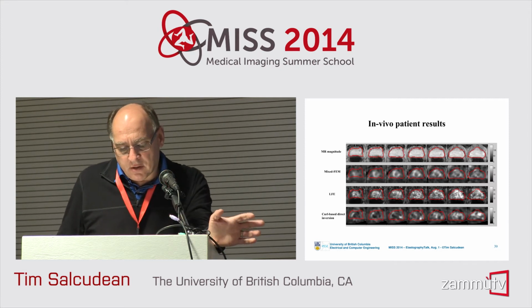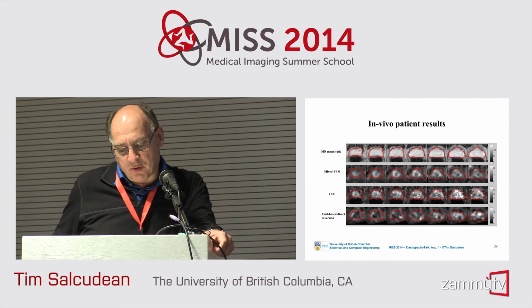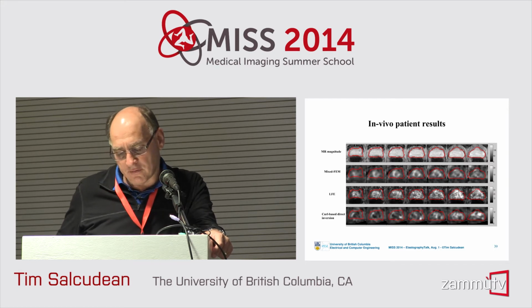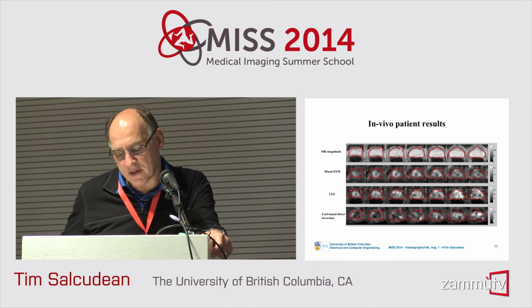We've done similar inversions for in vivo prostate, and I'm showing you this slide to show you that the inverse problem is far from being solved. Okay, the Mayo approach, which is the LFE, at the frequency range that we're able to excite the prostate, gives us pretty sorry data.